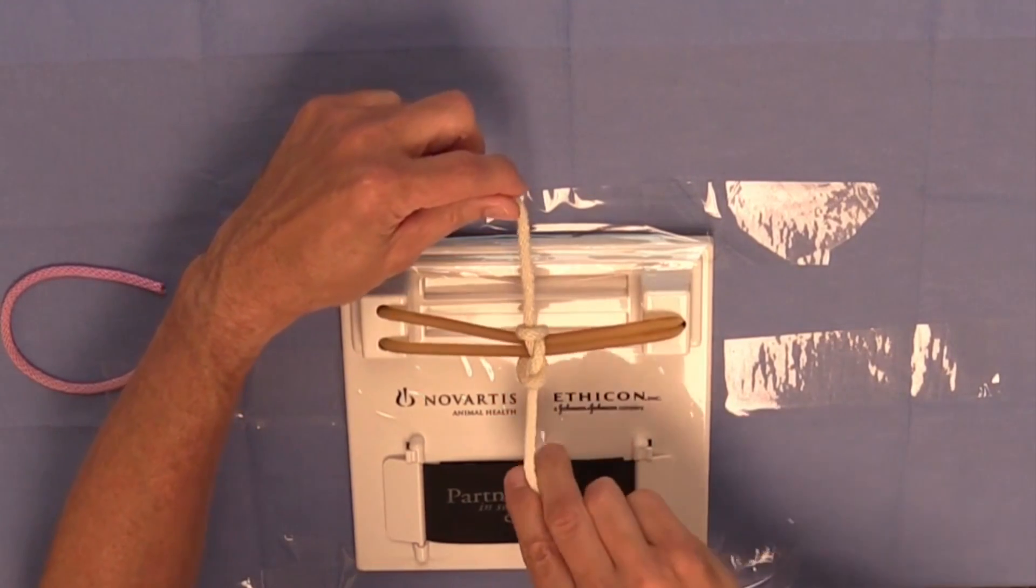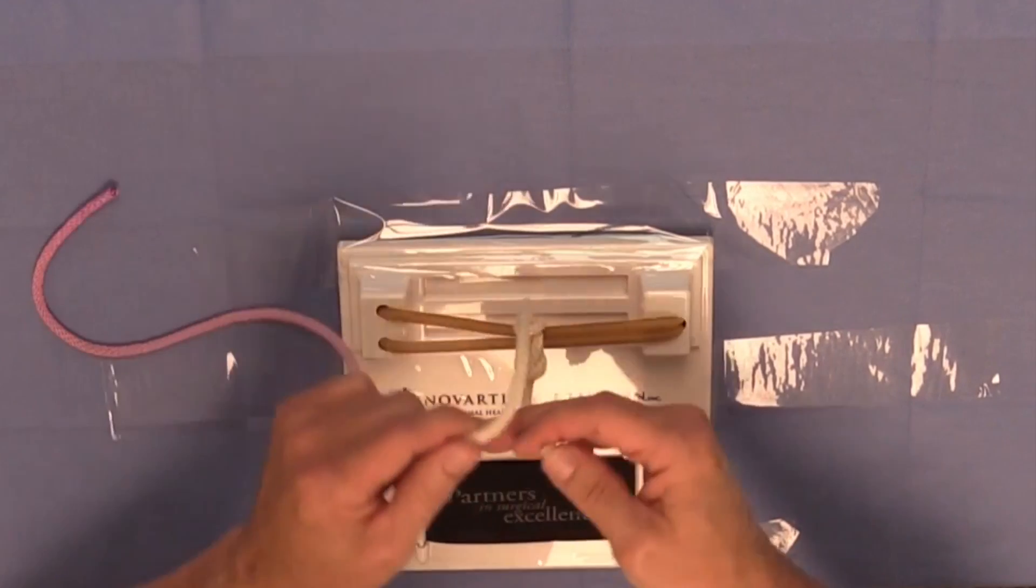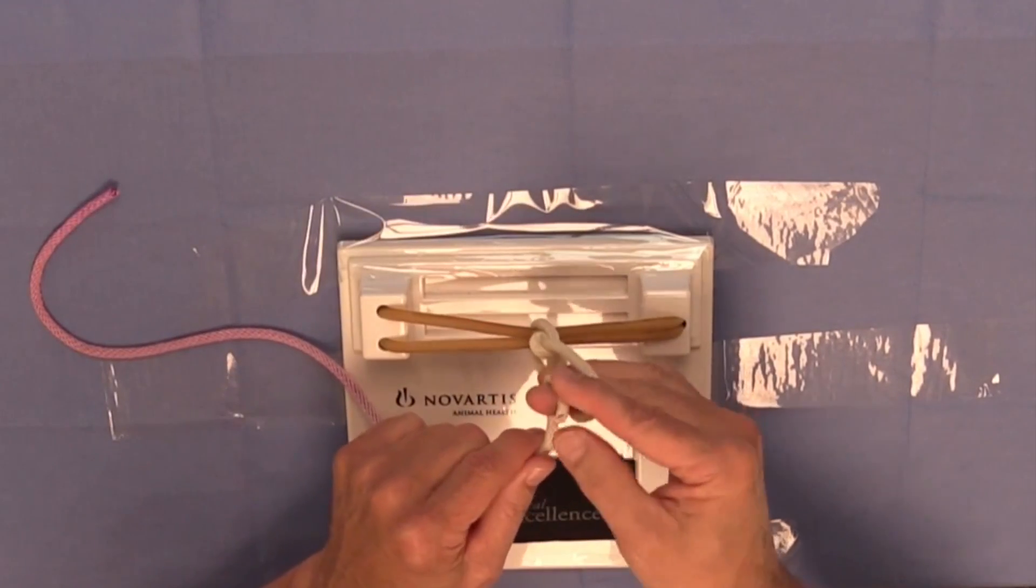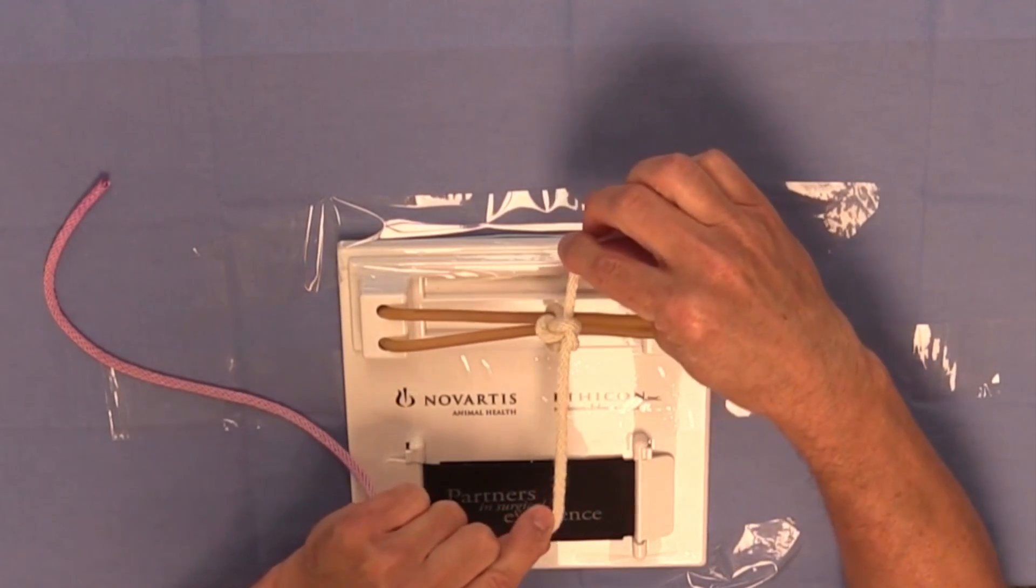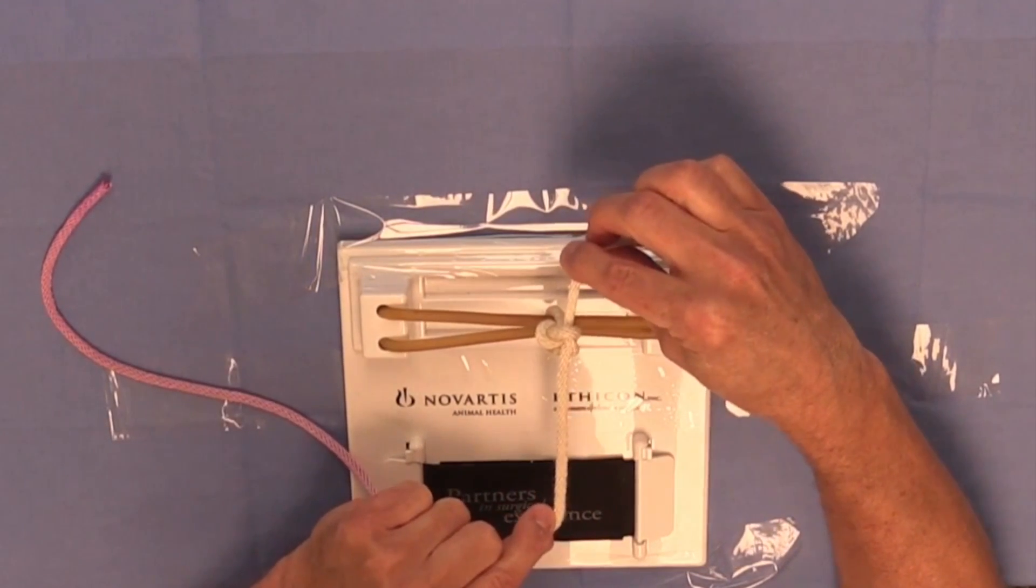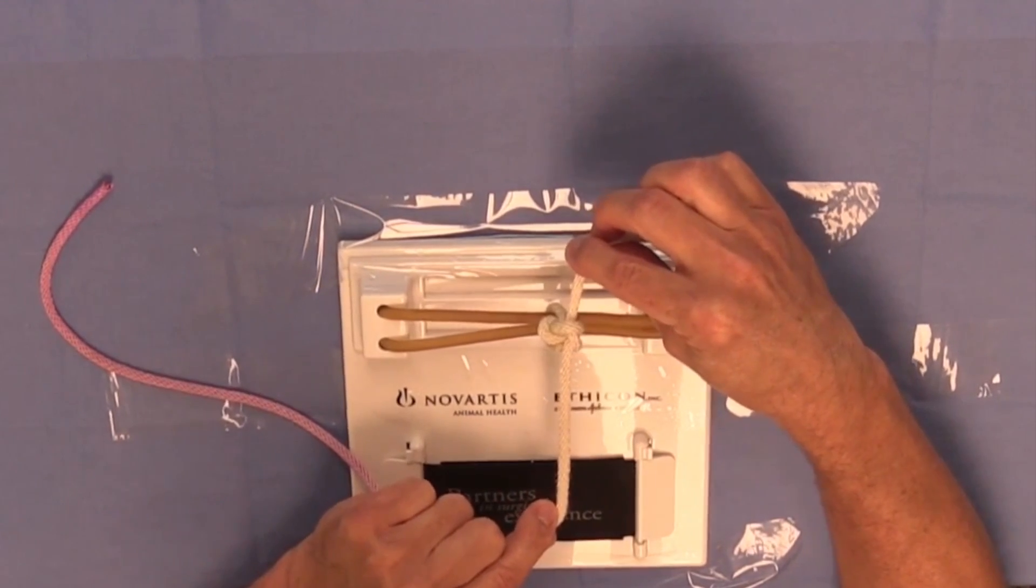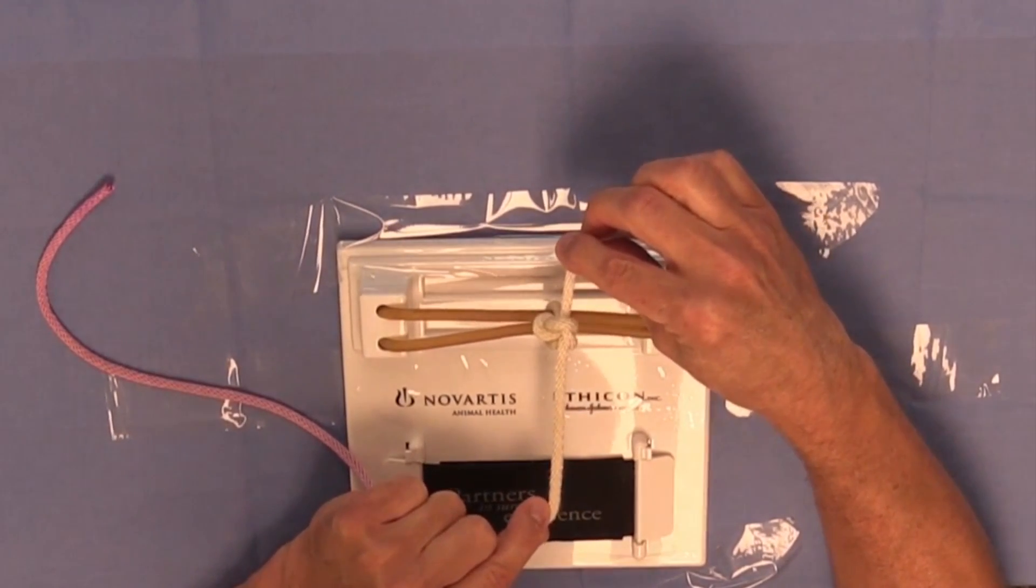I lay that down, and now I just finish the knot using a simple throw. And I have my surgeon's knot created using a one-hand technique in a different fashion than I demonstrated before.